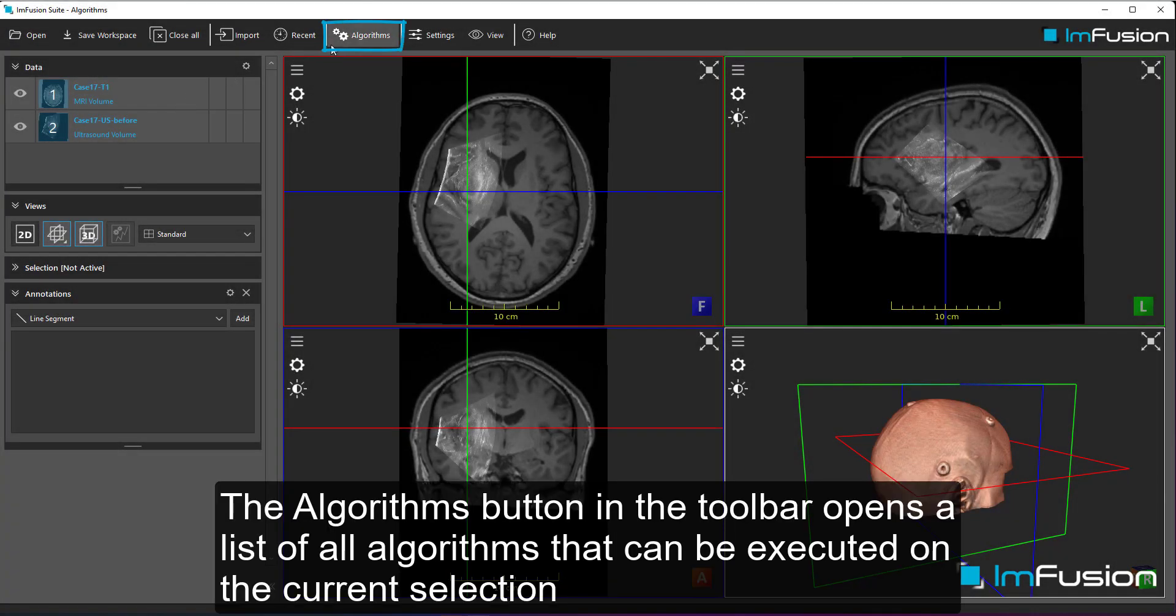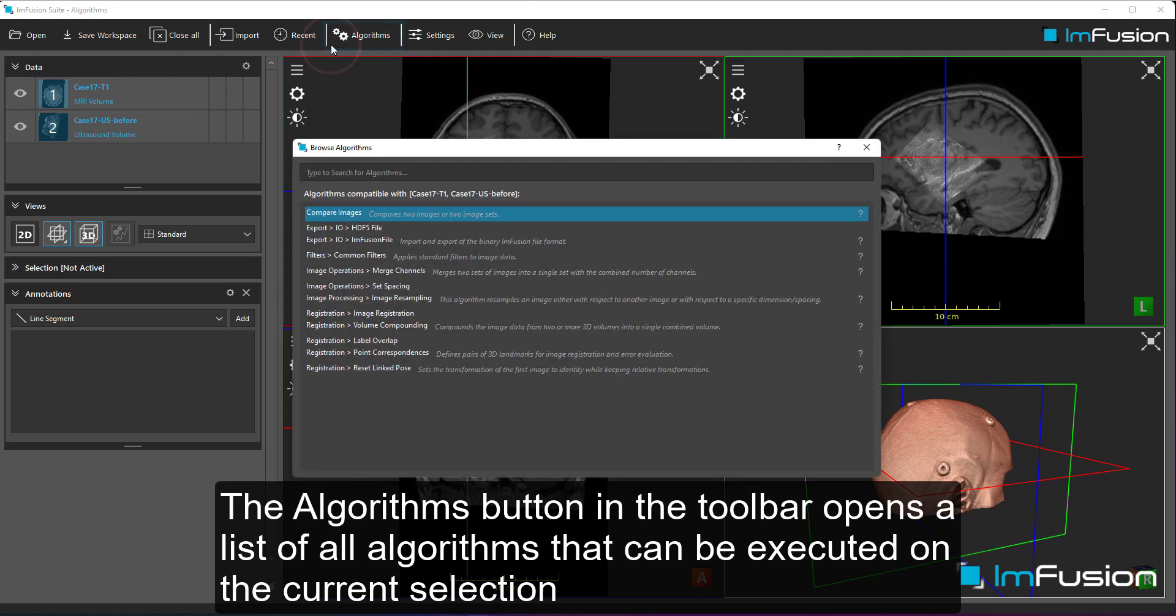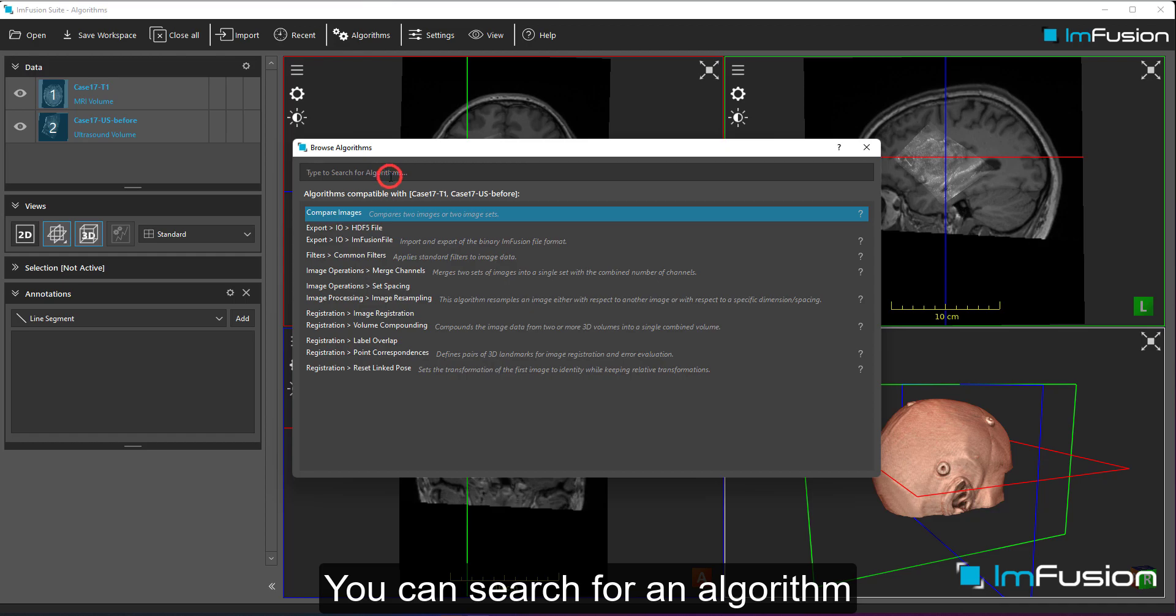The algorithms button in the toolbar opens a list of all algorithms that can be executed on the current selection. You can search for an algorithm.